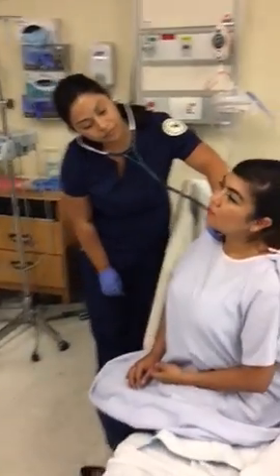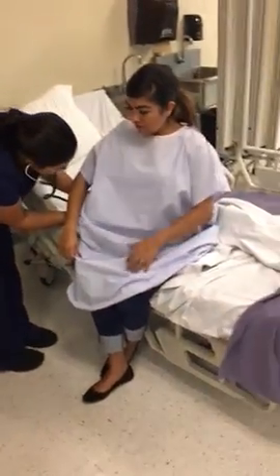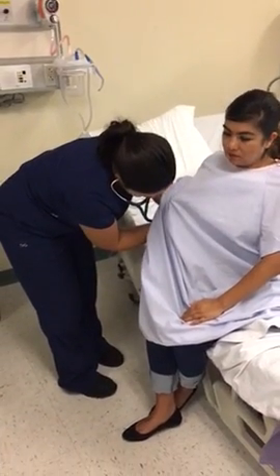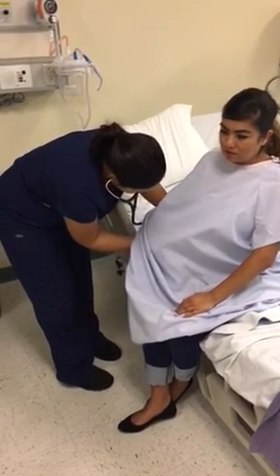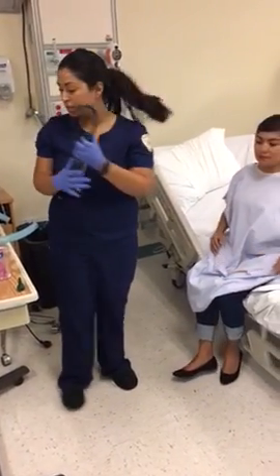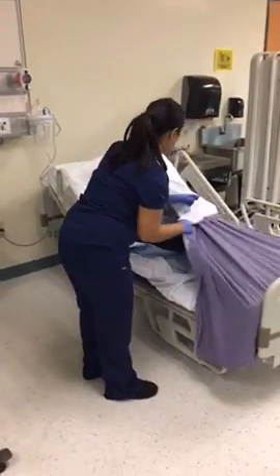Take a deep breath in. Okay, next I'm going to ask you to have your arms to the side a little bit. Thank you very much for being so cooperative. And if you like, you can go ahead and get back in bed and get nice and comfortable. Thank you. You're welcome. Okay, so let me help you with that. Oh, thank you, Briana.